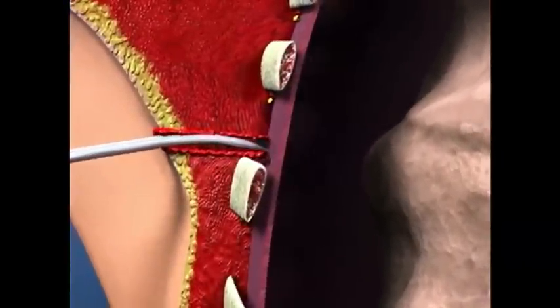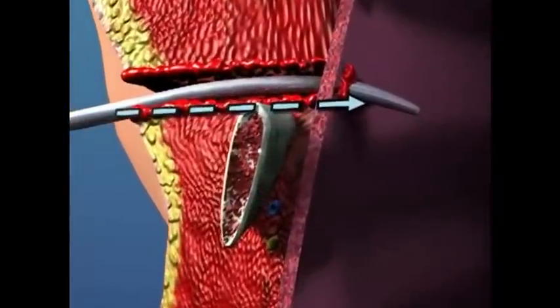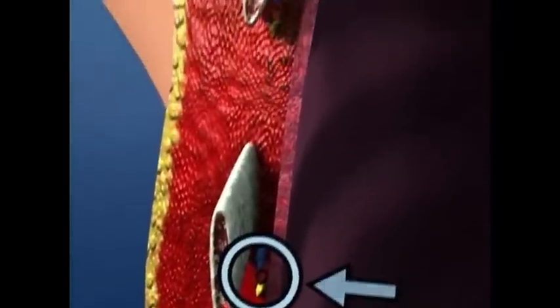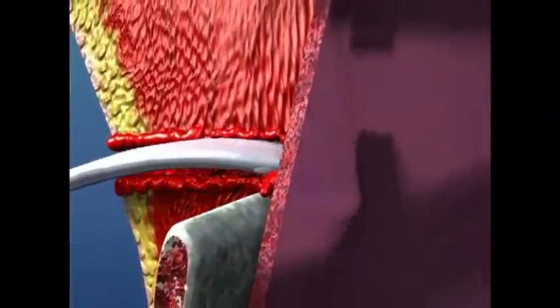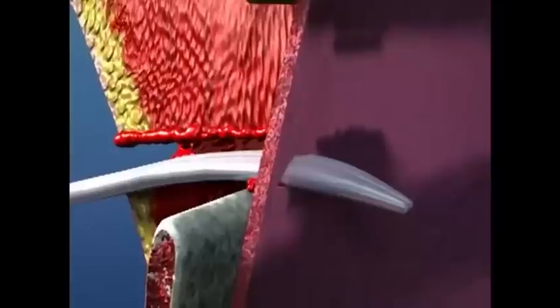With the tip of the hemostat, puncture the parietal pleura while pushing just at the top border of the rib. You must always enter the pleural space over the top of the rib to avoid damaging the neurovascular bundle that lies along the groove at the inferior border of each rib. Be sure to enter the pleura in a controlled fashion to avoid lacerating the lung with the hemostat.